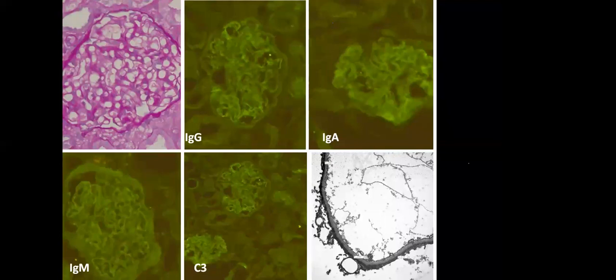So with this kind of morphology, there are only two differential diagnoses. If the patient has full-blown nephrotic syndrome, it is either minimal change disease or an unsampled FSGS. When I say unsampled FSGS, that means you are not finding the FSGS lesion in the biopsy sample provided to you. So if I'm seeing a biopsy sample in which there are 20 glomeruli, all those 20 glomeruli are showing normal morphology and there is no segmental lesion, I label that as unsampled FSGS if immunofluorescence is negative.